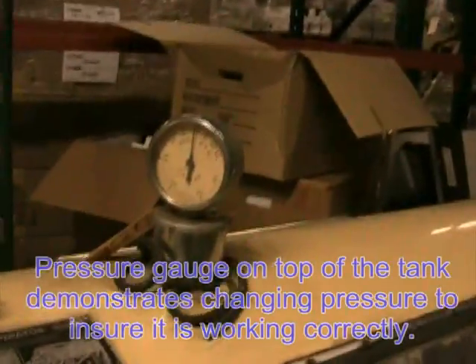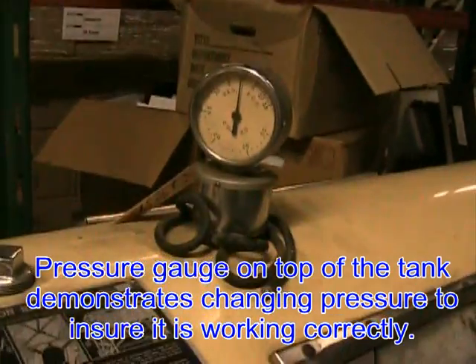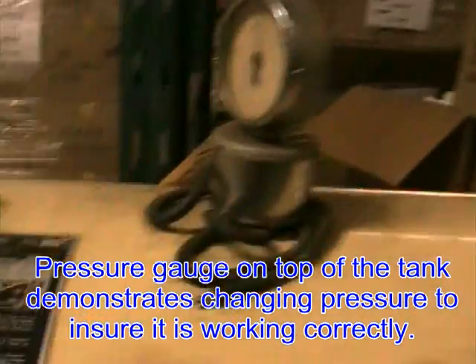On top is the pressure gauge, which tells how much pressure the patient is receiving. And this is the instructions, in case staff don't remember.